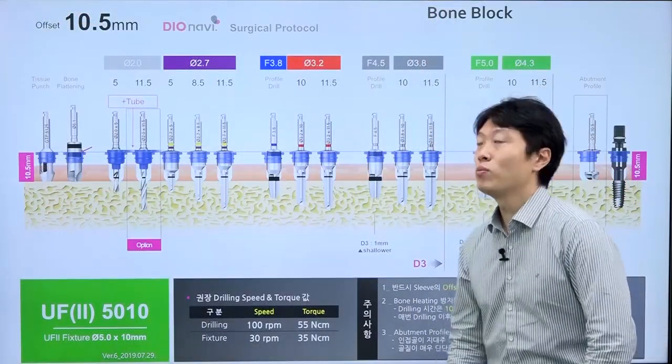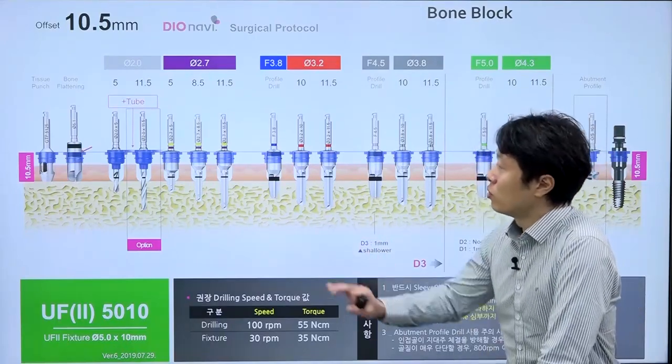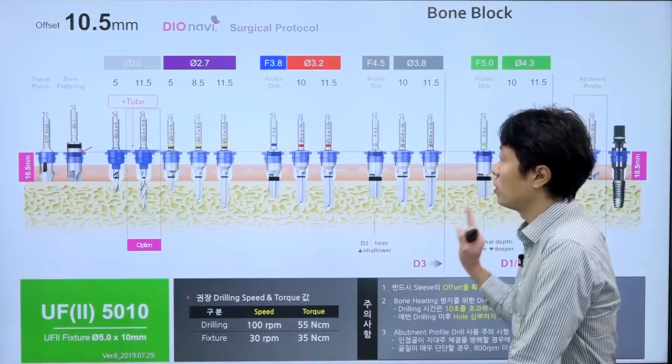Moving on, let's see what differences there are with the 10.5 mm offset. The overall drilling protocol is the same.